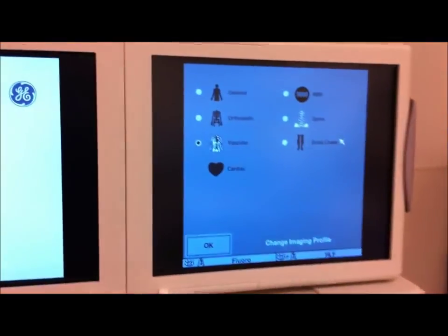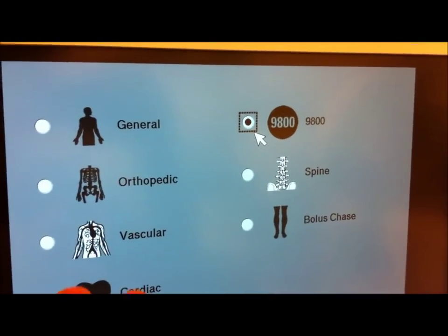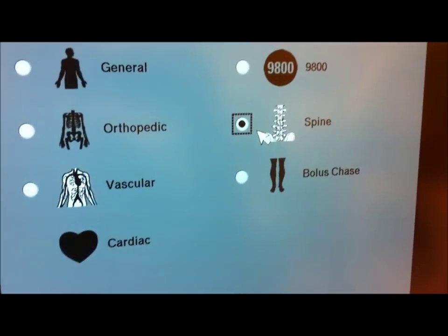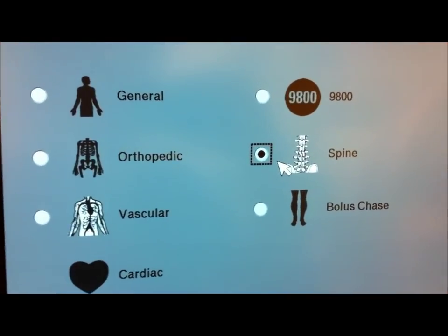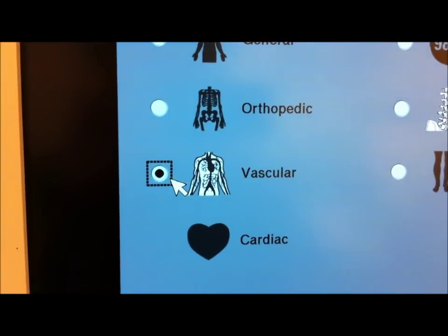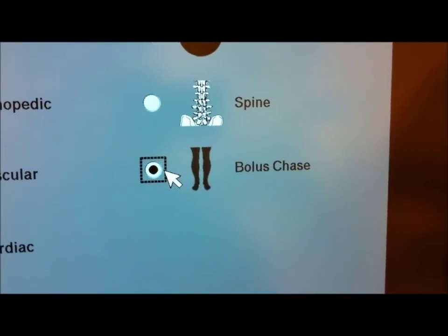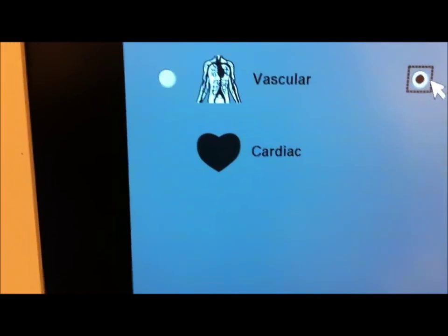This is particularly new with the 9900. You can choose a general profile for general fluoroscopy, 9800 mode which emulates the quality of the OEC 9800, orthopedic which applies filters to sharpen bones, spine which is geared towards spinal fluoroscopy with special filters to improve image sharpness and definition of bones, vascular with its own particular profile for vascular modes, and bolus chase which improves image quality when injecting IV contrast — basically trying to chase a bolus of IV, for instance during an angio of the legs. Unfortunately we don't have the cardiac profile here as we don't do many cardiac cases.